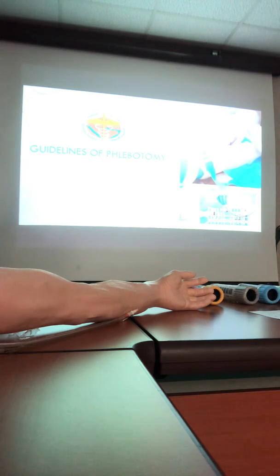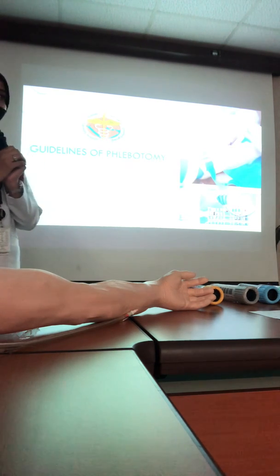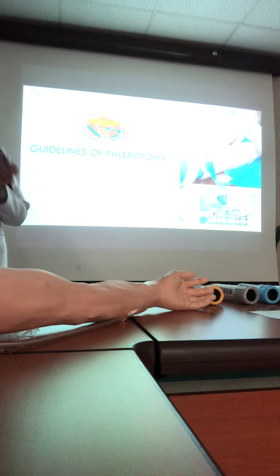It is a Greek word, phlebo and tomy. Phlebo means vein and tomy means cutting off, so cutting the vein. Nowadays, we just puncture the vein to extract the blood sample for the analysis. So the exact meaning nowadays is venipuncture, not phlebotomy.